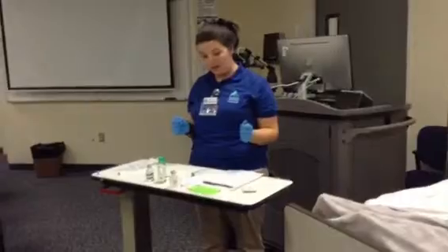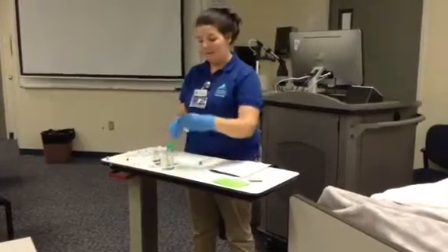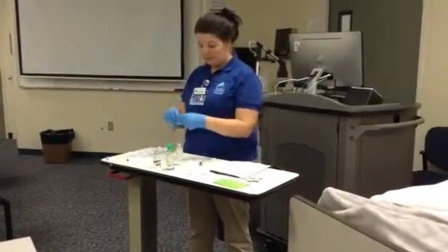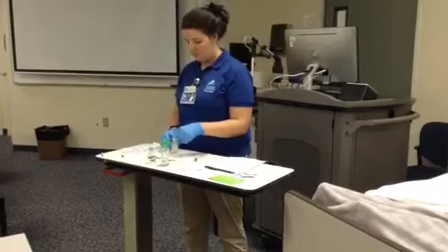Now I'm getting ready to go into my SASH procedure. I'm going to get my saline, clean the top off. Alrighty.